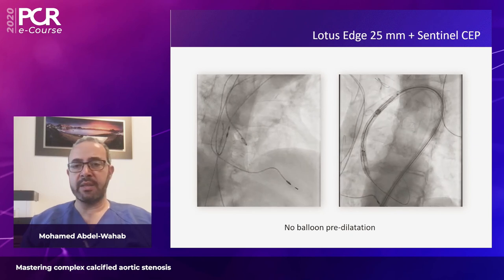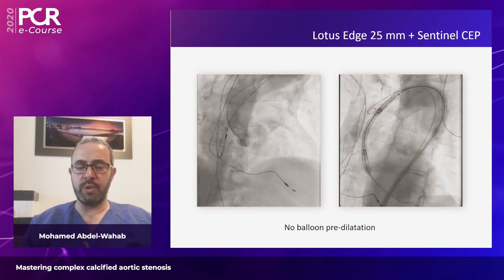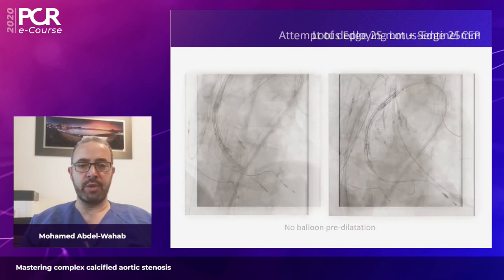You can see here that we had some difficulties in crossing the arch. That was a little bit tortuous, and this is why we did this aortic arch angiogram. But at the end of the day, it was possible to cross.